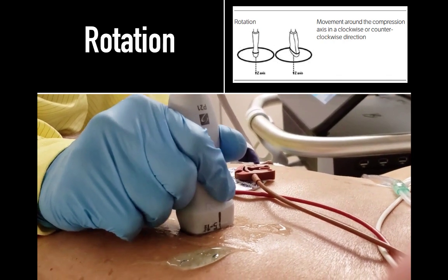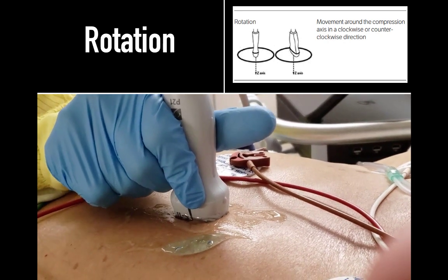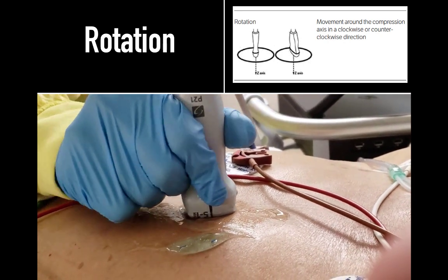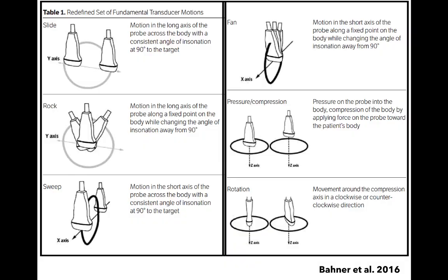Rotation, again, pretty self-explanatory. I will say most novices find it challenging to hold the probe in a good position and rotate it. This takes time. I would suggest you anchor the probe with one hand and use your other hand to rotate it. So here we go.